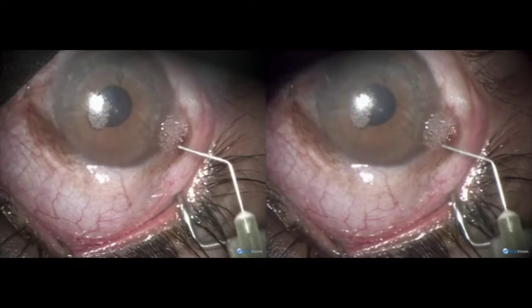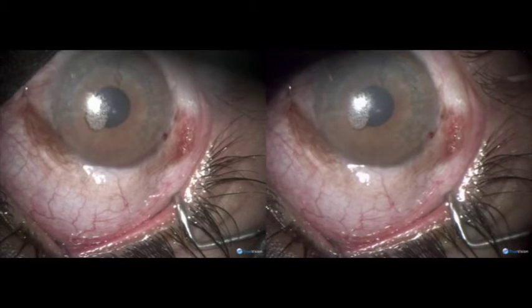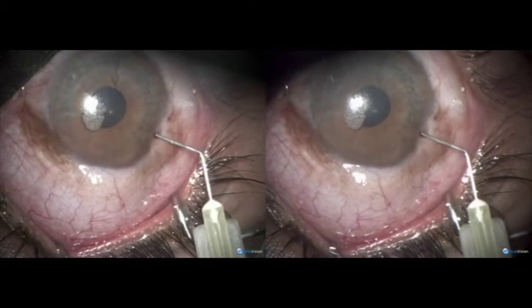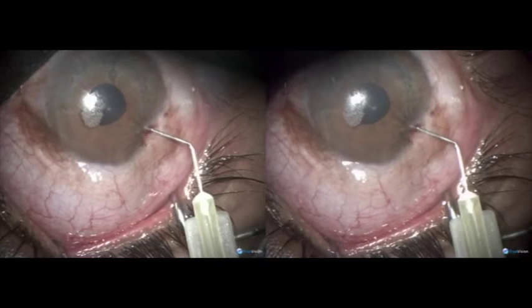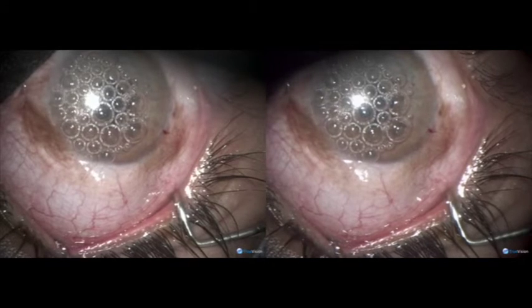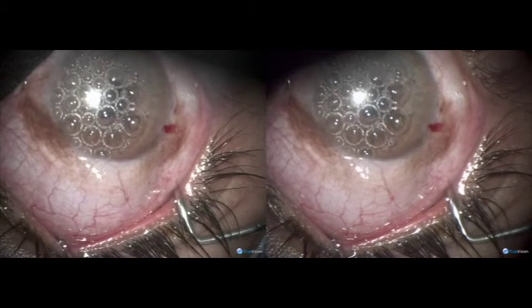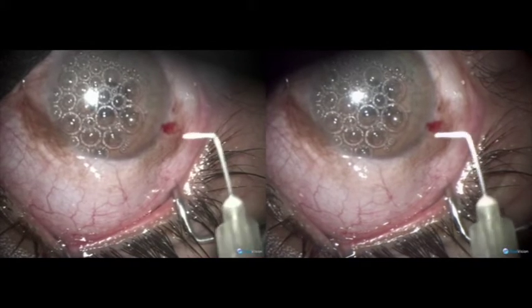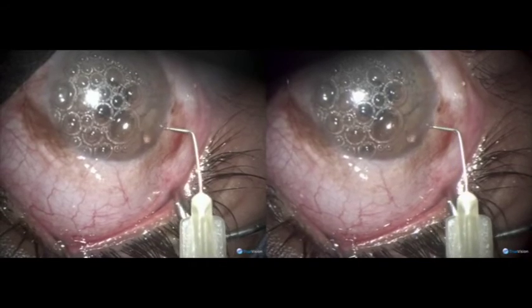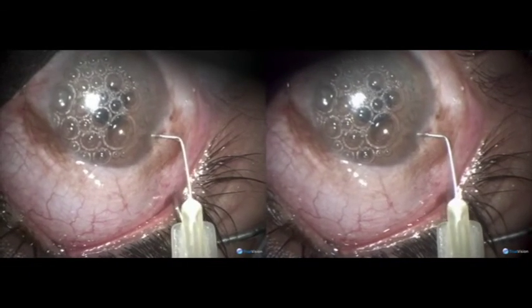In this case, first we deepen the anterior chamber by injecting air. After that, we inject saline with carbachol to contract the pupil. The pupil contracts immediately.